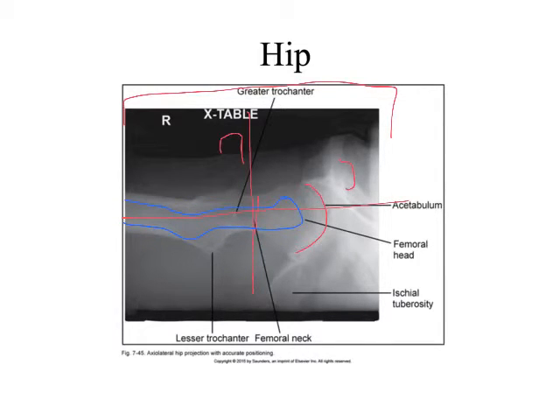If I have not included all the hardware, I may need to recenter. Okay? Again, I can use that bandage as a cheat. But generally what they're looking at for that, when they look at the hardware on the lateral, most surgeons will tell you, it's been my experience, I could be wrong, but it's surgeon dependent, I guess is what I should say, institution dependent.